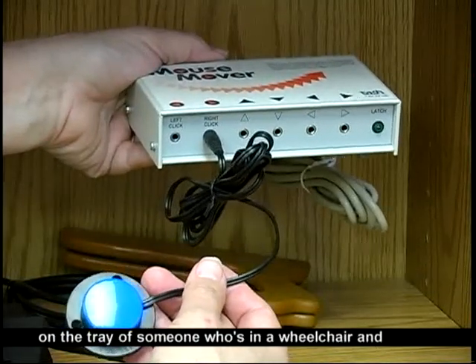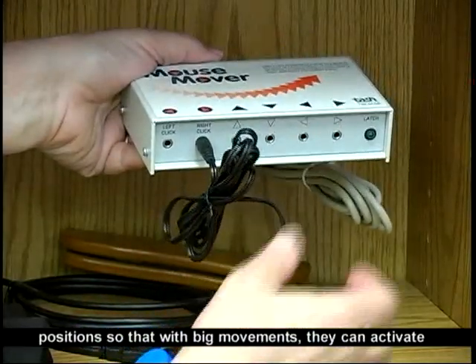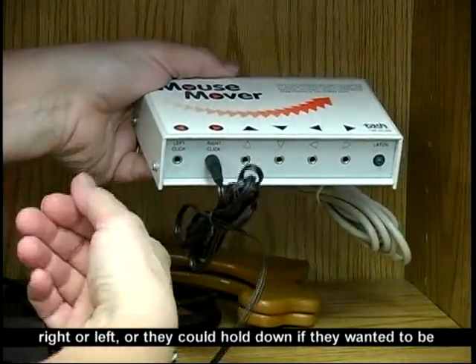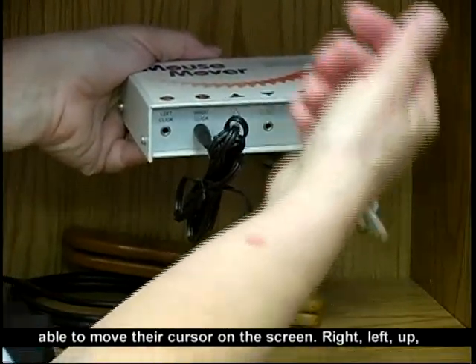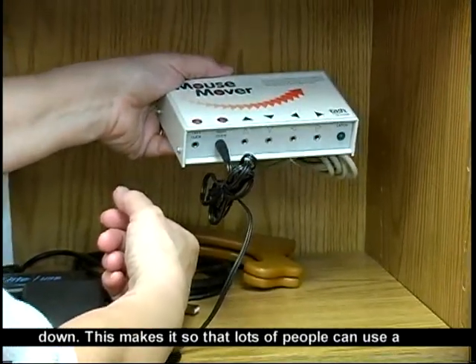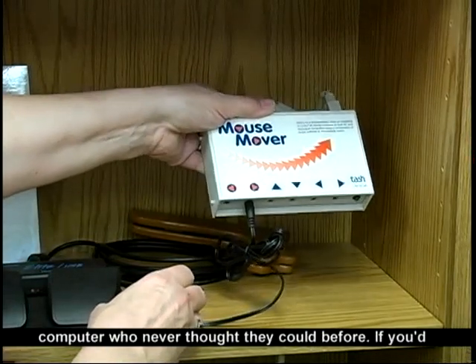These could be placed on the tray of someone who's in a wheelchair and positioned so that with big movements they can activate right or left, or they could hold down if they wanted to move their cursor on the screen right, left, up, or down. This makes it so that lots of people can use a computer who never thought they could before.